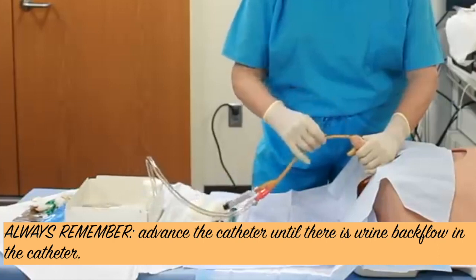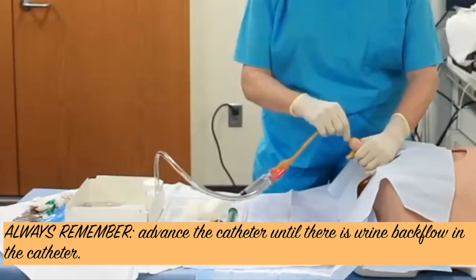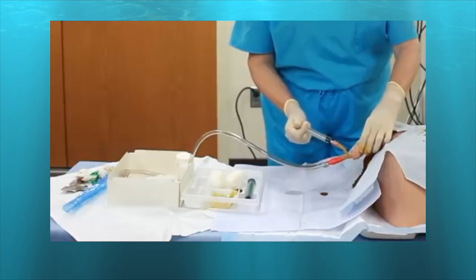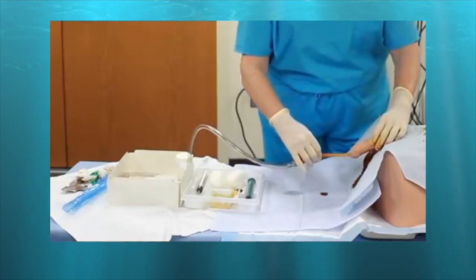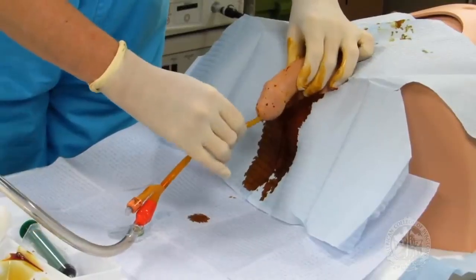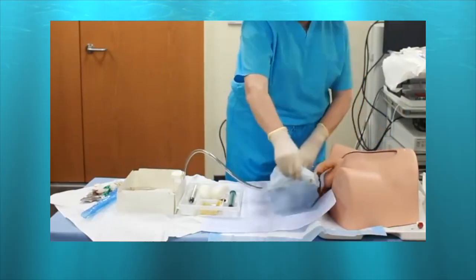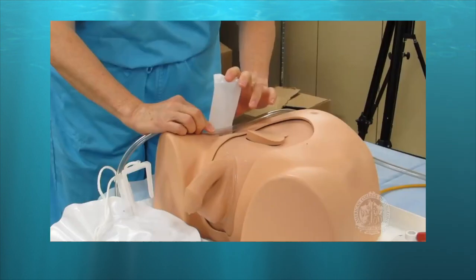Insert the foley catheter until a backflow of urine is seen in the urobag. Once there is backflow, push the 10cc sterile water to inflate the balloon and secure the catheter. We are done. Now it is time to anchor the tube — clean the area and secure the foley catheter tube to the patient's leg.